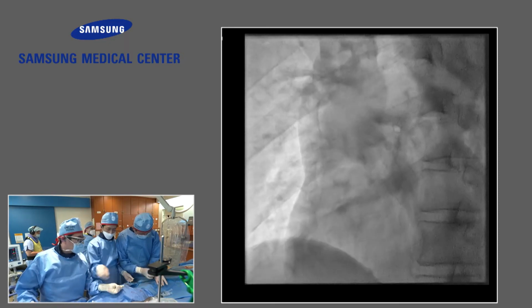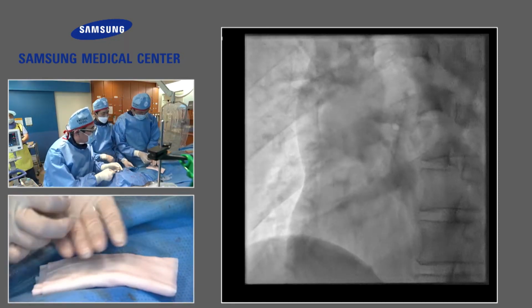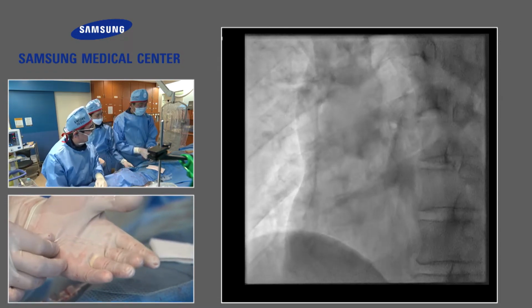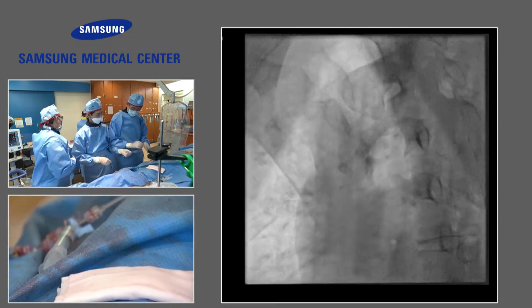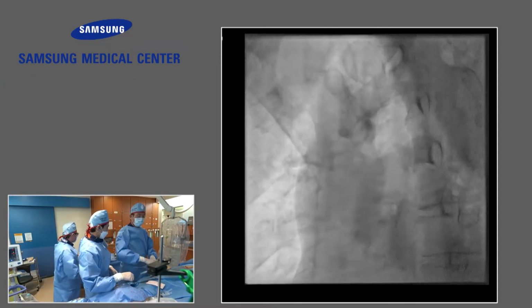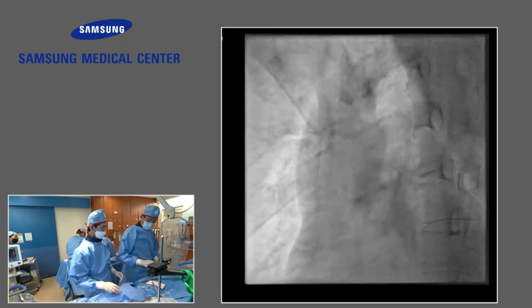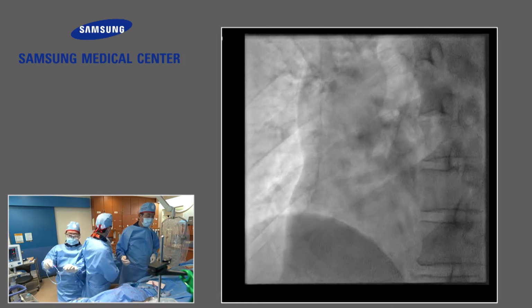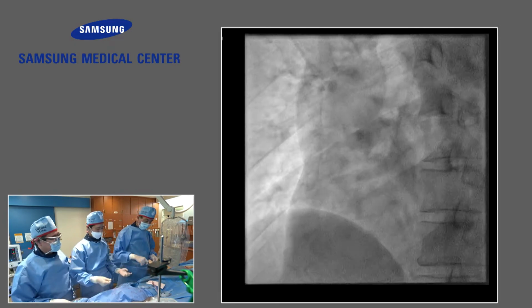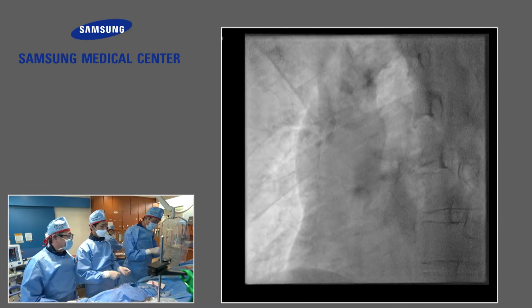Oh, that's another adhesion area. Dr. Gwon, once you have enough time, but you do not have enough time. Please hurry up. How many minutes do I have? About 20 minutes. Okay, 20 minutes. That's enough. We believe in your expert skill. 20 minutes is enough, I think.